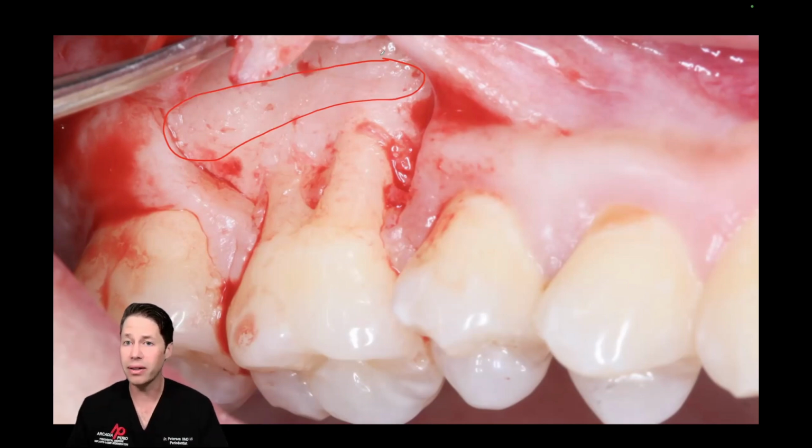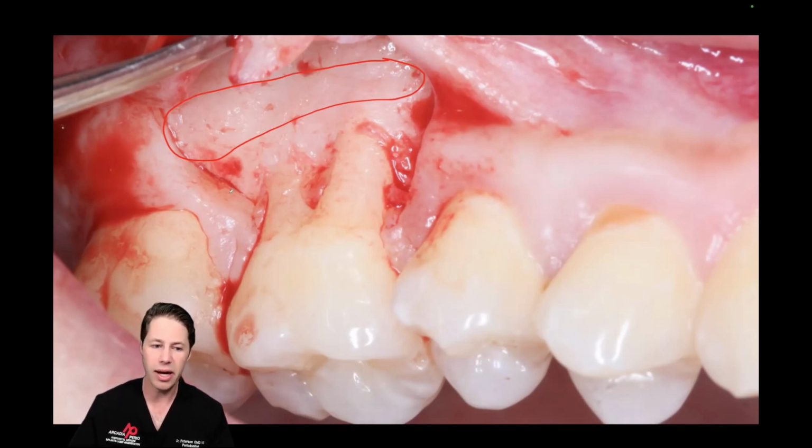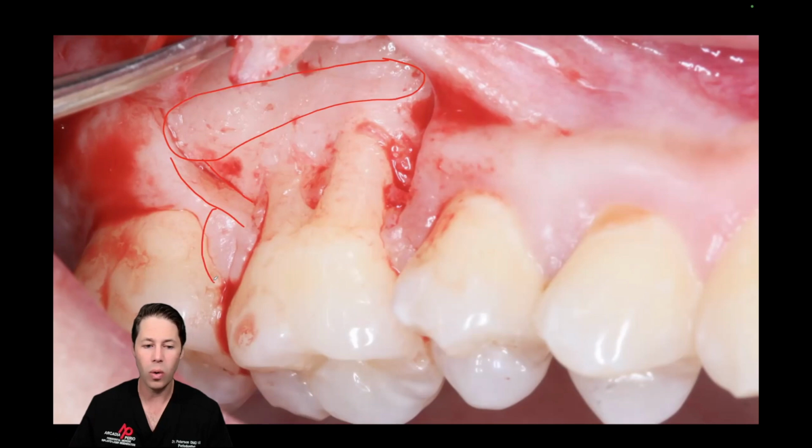So with a Langer and Langer approach, or 2 vertical releases, you can see here a beveled incision, increasing the surface area for tissue to become attached. And then the papilla will be deepithelialized either with a 15 blade or a diamond round burr. This allows me to get, one, good access to the furcation.